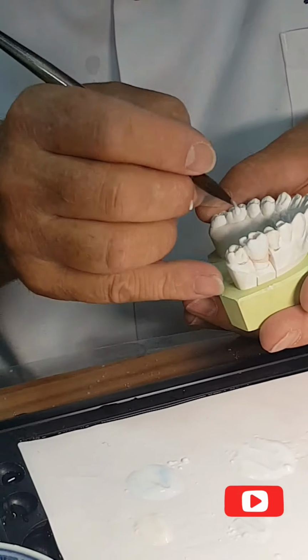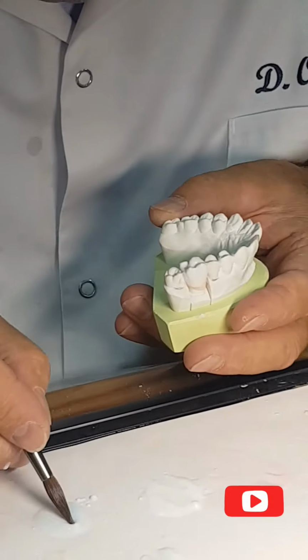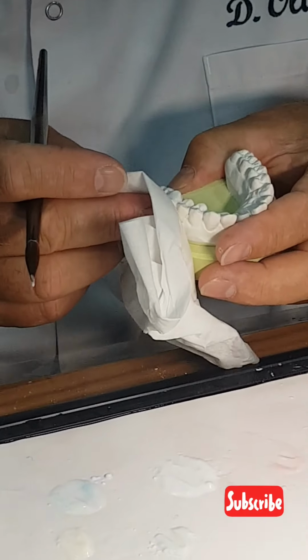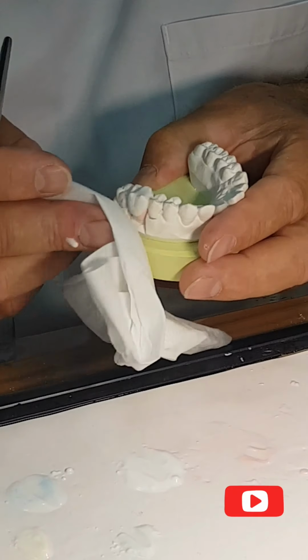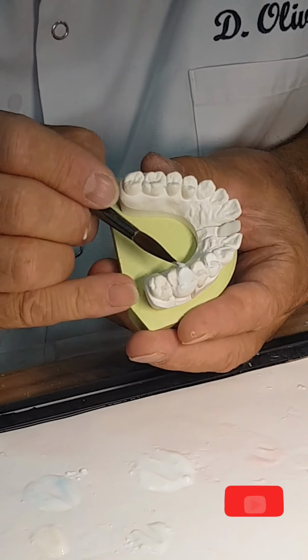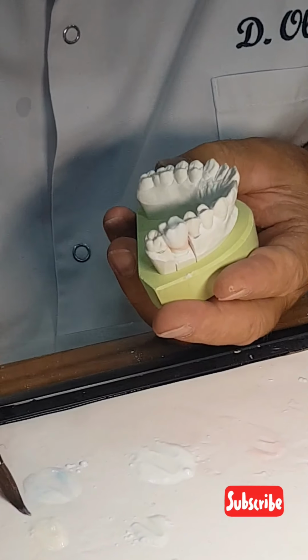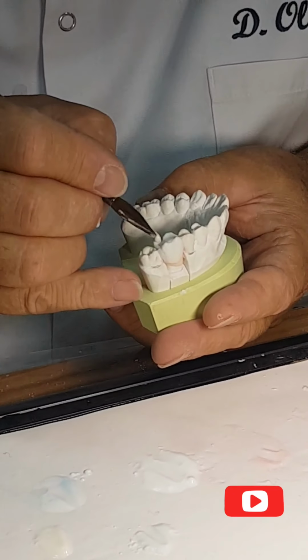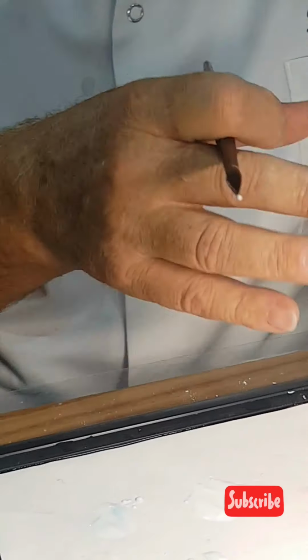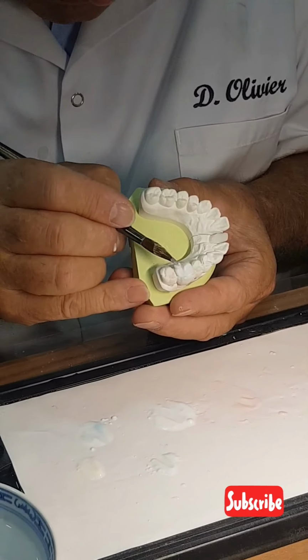And I continue very fast here with my enamel inside. I put quantities. I don't try to obtain something beautiful. You are certainly, at that time, a little disappointed because you say, oh, his crown is not beautiful. Please, give me 5 minutes. That's the dentine. That's the enamel. Here, enamel. And I overbuild. The more important thing is to respect the anatomy. After the groove, I will regulate it later.